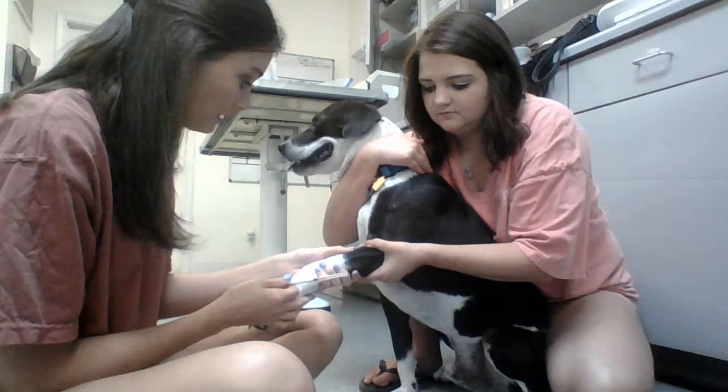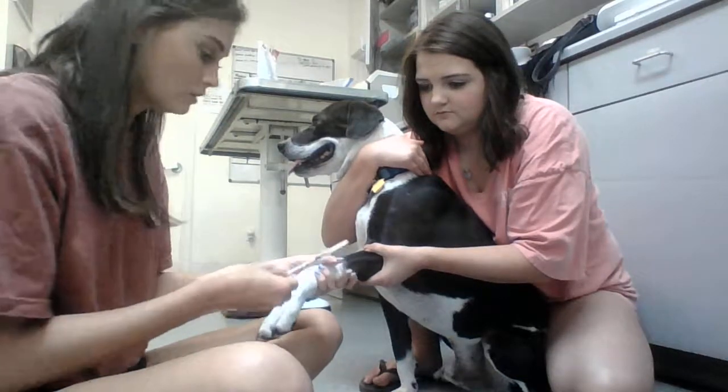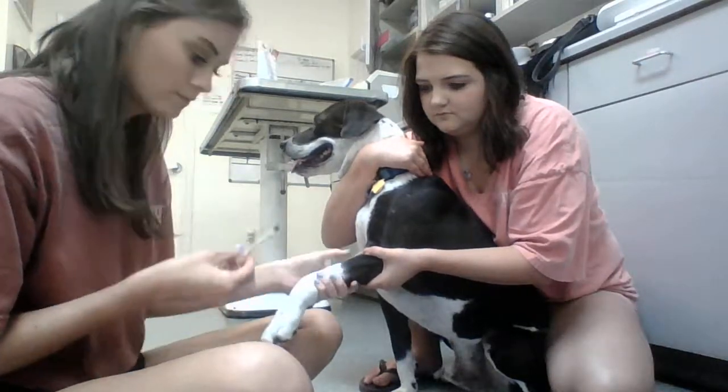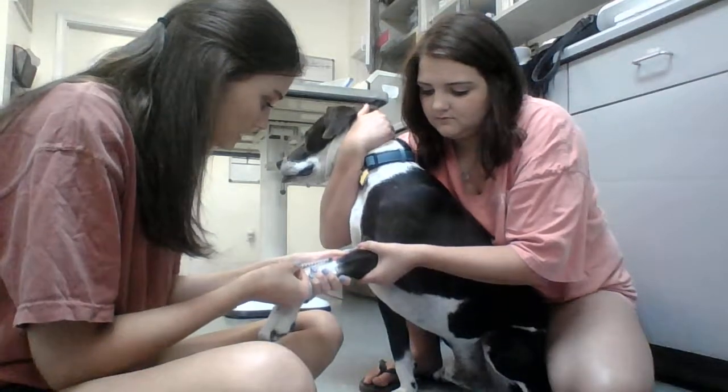I like to isolate the vein with my thumb so that I can feel it and it doesn't roll away from me. Then I take my cap off, put my bevel up, feel the vein, and do a little stick.